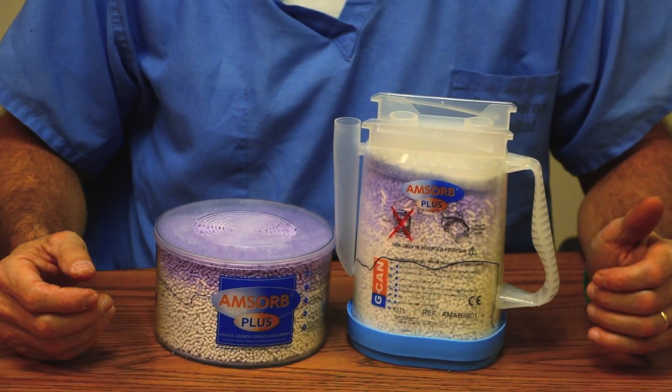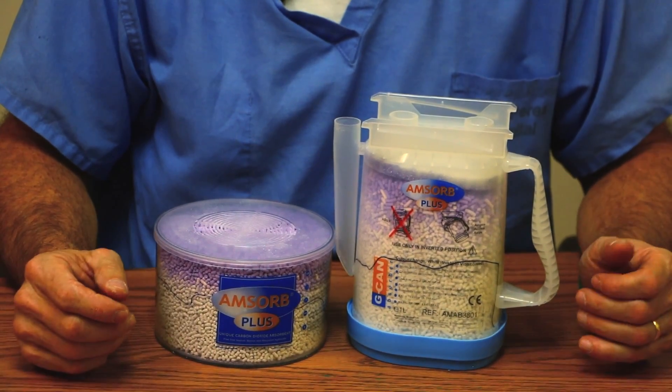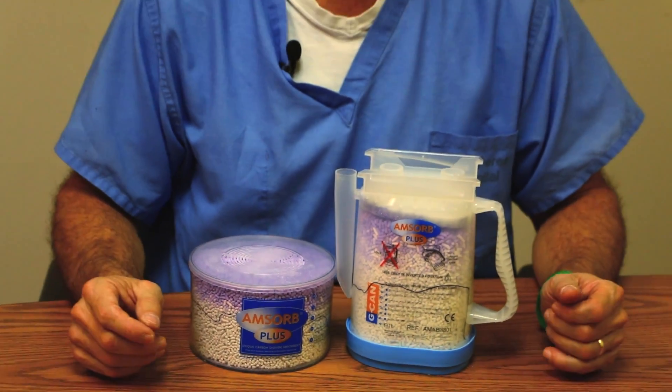CO2 absorbent is a controversial issue at this time because there are absorbents called soda limes that have been traditionally used. Soda limes create toxins when they are desiccated, so they will produce Compound A, formaldehyde, and carbon monoxide.